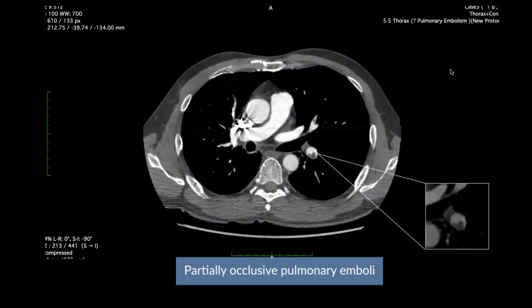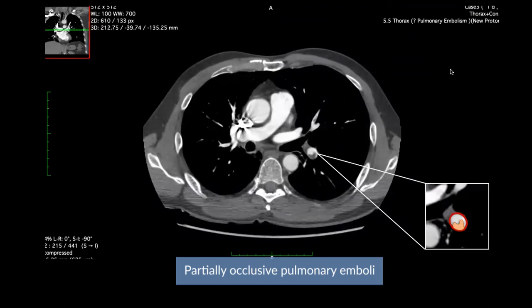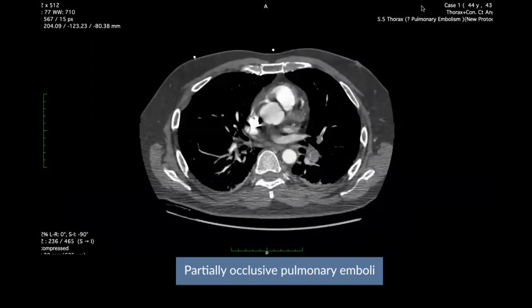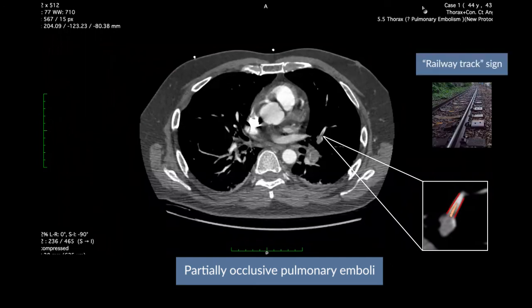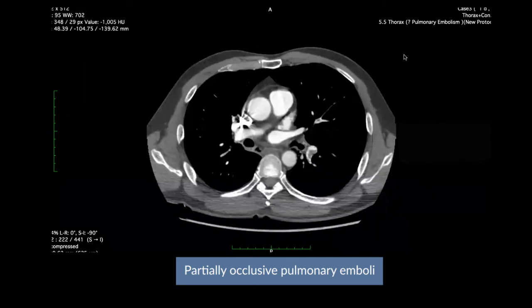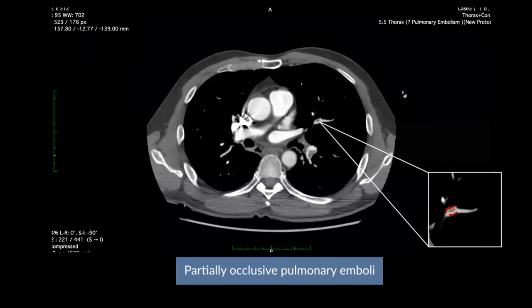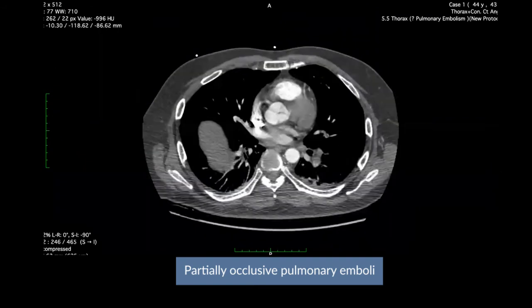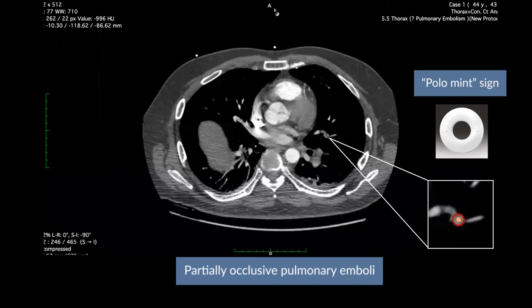This is another example of a partially occlusive pulmonary embolism where the thrombus is seen peripherally against the vessel wall. A partially occlusive thrombus can also be seen surrounded by contrast material in its long axis, forming the railway track sign. Here we have another example of the railway track sign. If there is a partially occlusive thrombus seen in a vessel in cross section, this can form the polo mint sign.